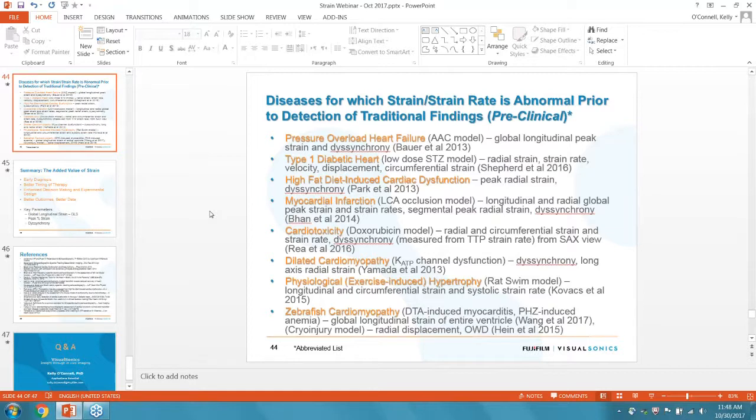Yeah, that's certainly been my experience from use and from showing people the software, that the majority do seem to go for the long axis image rather than the short axis. I think the general consensus maybe is that there's more information in the long axis than in the short axis. Well, I think part of it is that the GLS number, the global longitudinal strain number, is a very robust number that's been studied a lot. We don't have that same background of data on a global circumferential strain number.